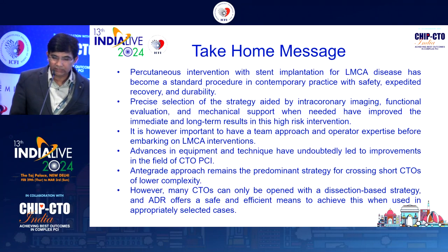Yeah, the left circ ostium is not okay, but because of the complexity of the case and the patient developed an arrest in between, I left it like that after ballooning the LCX portion. And because initially also the LCX ostium had minimal disease, not significant, I didn't want to mess it up again after 2.5 hours of procedure.